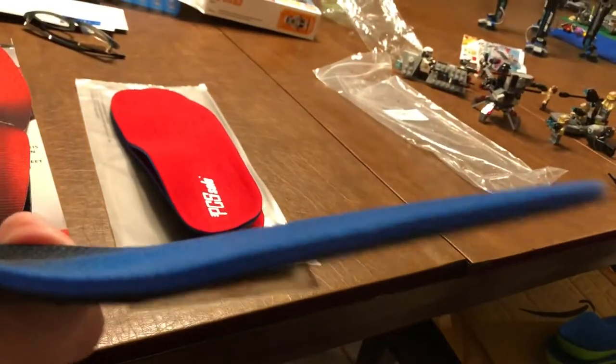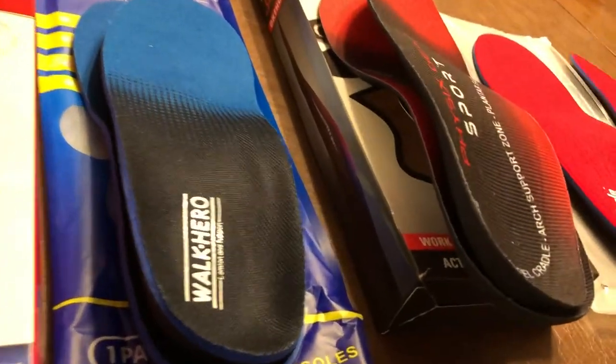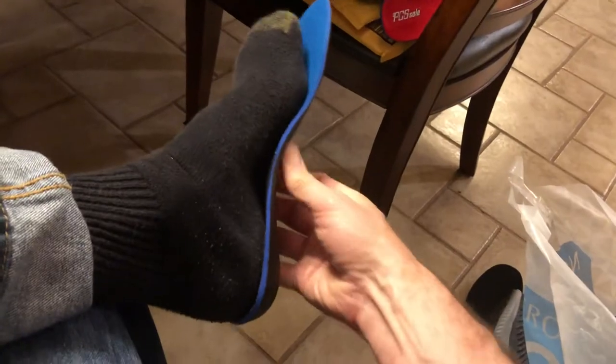Walk Heroes do a decent job of being stiff and are about as thick as Superfeet, but when you check the arch support there's a big gap — I can't feel any arch support at all. PCS soles are rejected: not only thick in the front, but no arch support for someone like me. Power Steps also aren't very good for arch support, though I like how thin they are. Walk Heroes, same issue — I can just swim my thumb around under the arch.